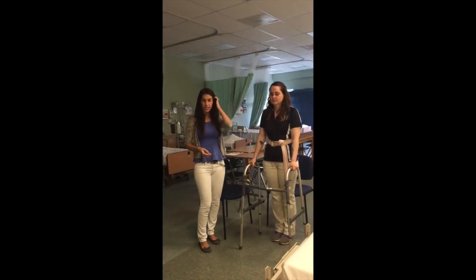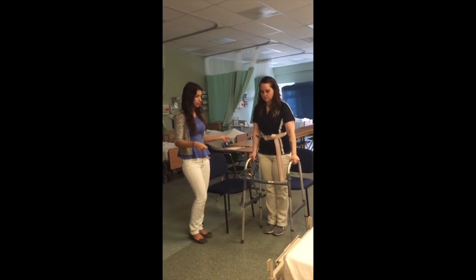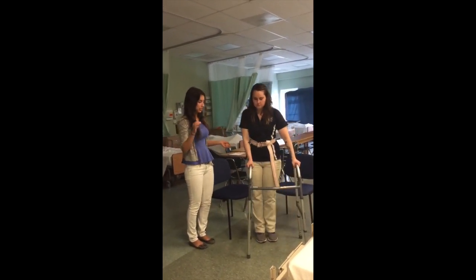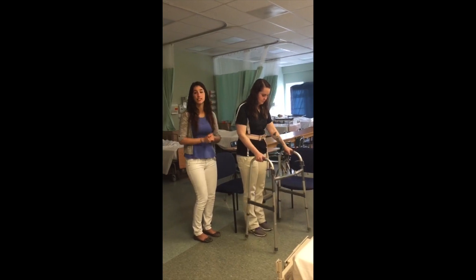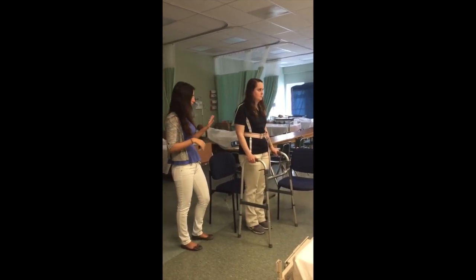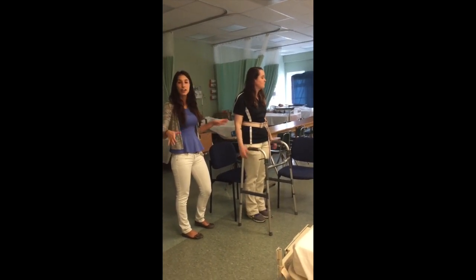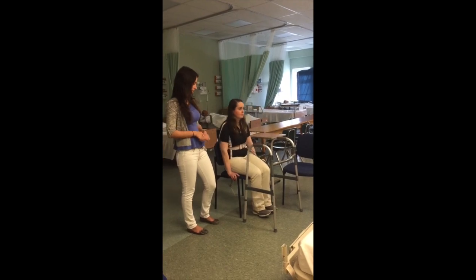Now we have the patient standing. The next part of the transfer is the step. She is going to take a step to the side, reposition the walker in front of her, and take as many steps as necessary until her knees are positioned right against the chair. As soon as she feels the chair, she's going to let go of the walker, reach back for the arms, and sit herself down.